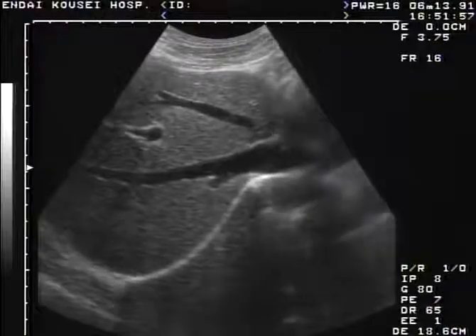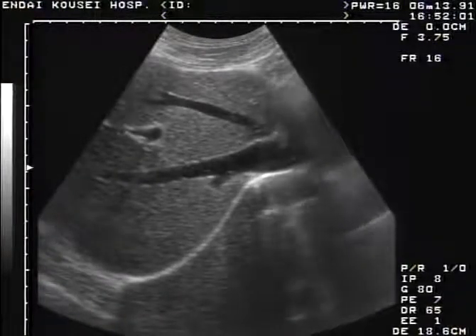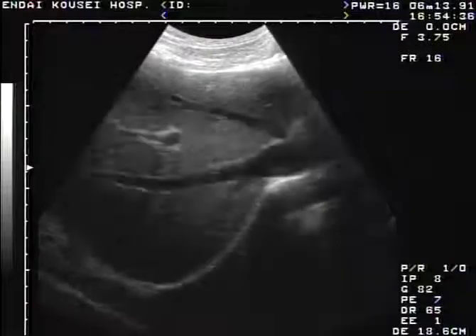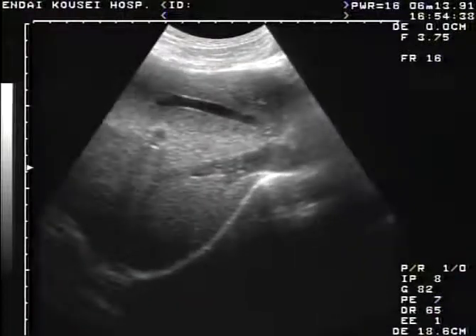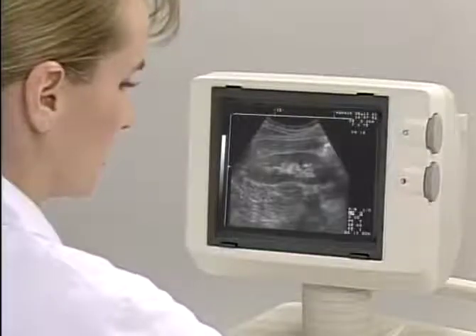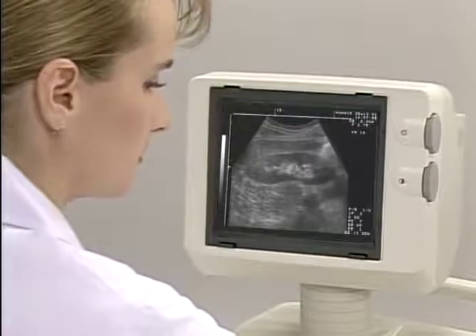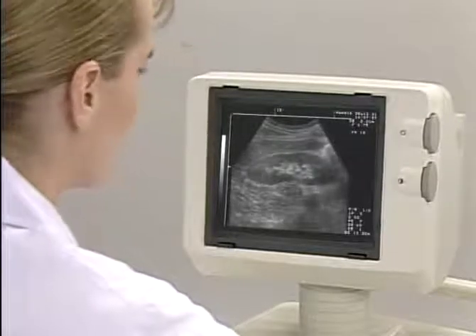For example, the echoes from a normal hepatic parenchyma should produce a uniform image. Adjust the STC knobs carefully. Incorrect settings may generate lesion-like images, leading to misdiagnosis. You can adjust the image on the monitor rather freely until you are satisfied.